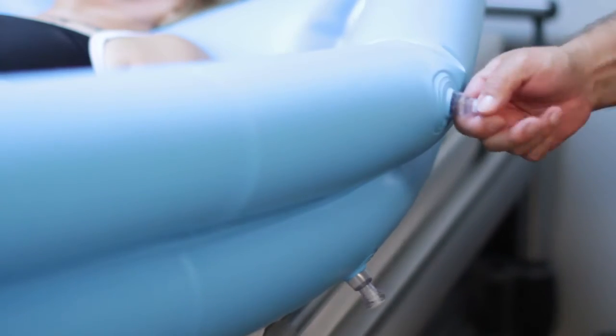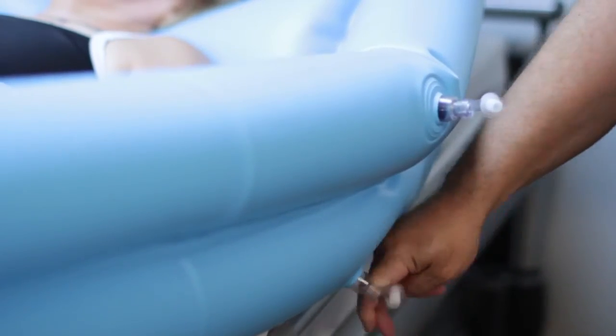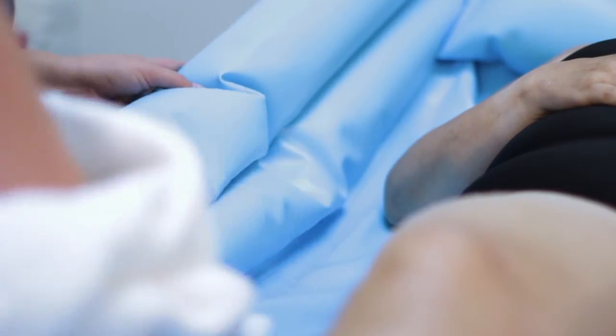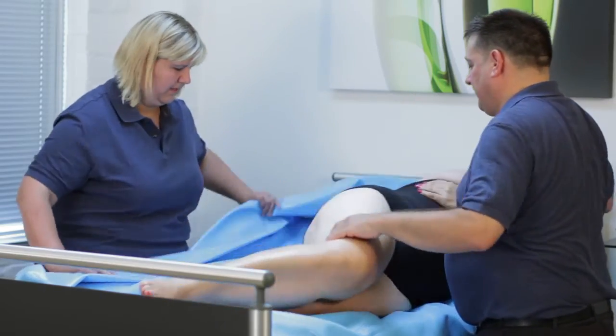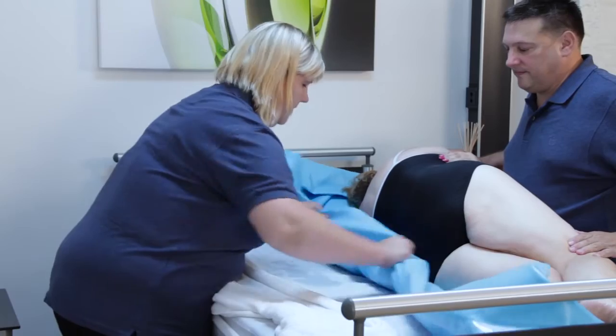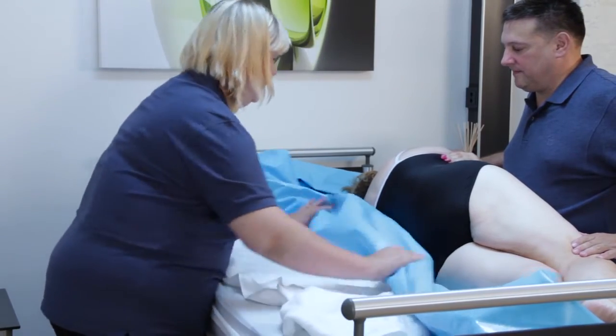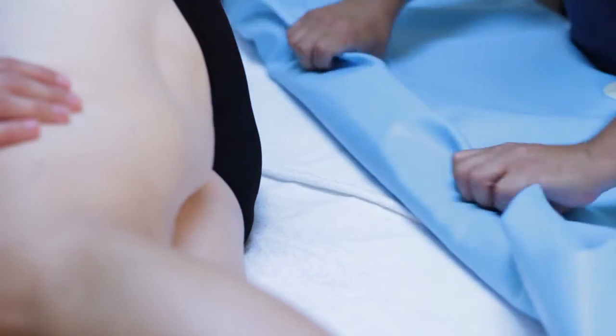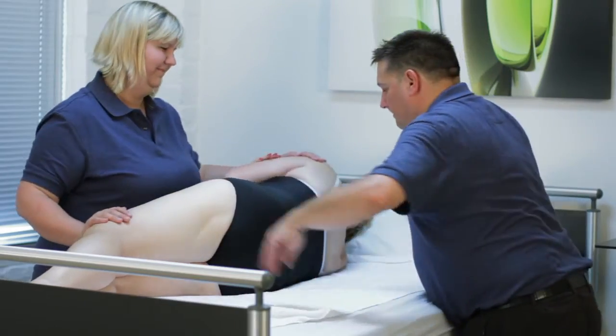Deflate the bath by pulling out the stoppers of the inflation valves. One carer should dry the patient while the other dries the bath. Roll your patient toward you and roll in the far side of the bath. Place a dry towel on the bed and roll your patient onto the towel. Remove the bath from the bed. Dry and dress your patient.